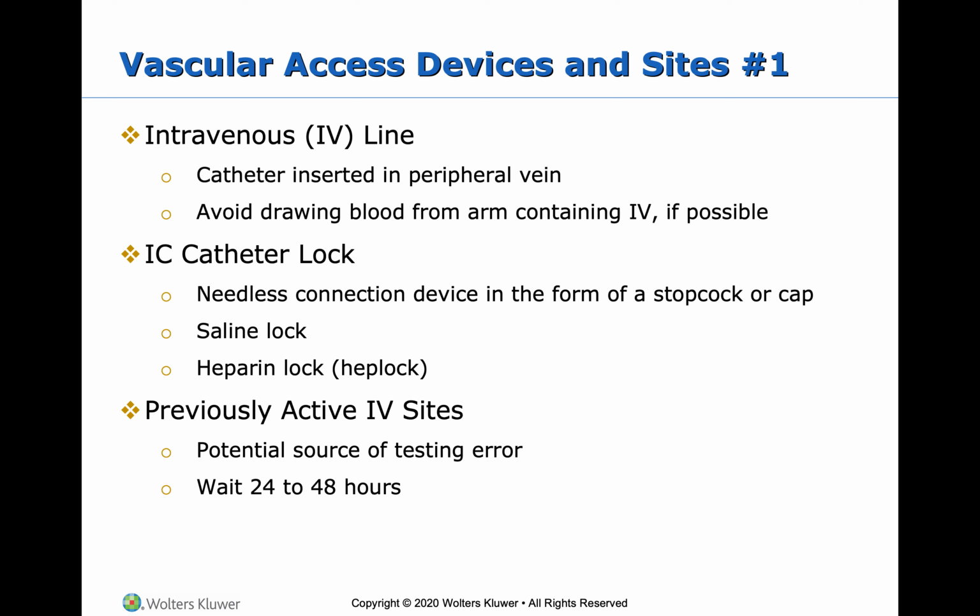It's an open system, so it's not closed off. When you open it up, it's open to the environment, open to the atmosphere. So that's why a lot of times it's a heparin lock. They flush heparin through it to make sure that it doesn't clot off. More commonly now, though, they're using saline, but if it's ever opened, it must be flushed with either saline or heparin every time.